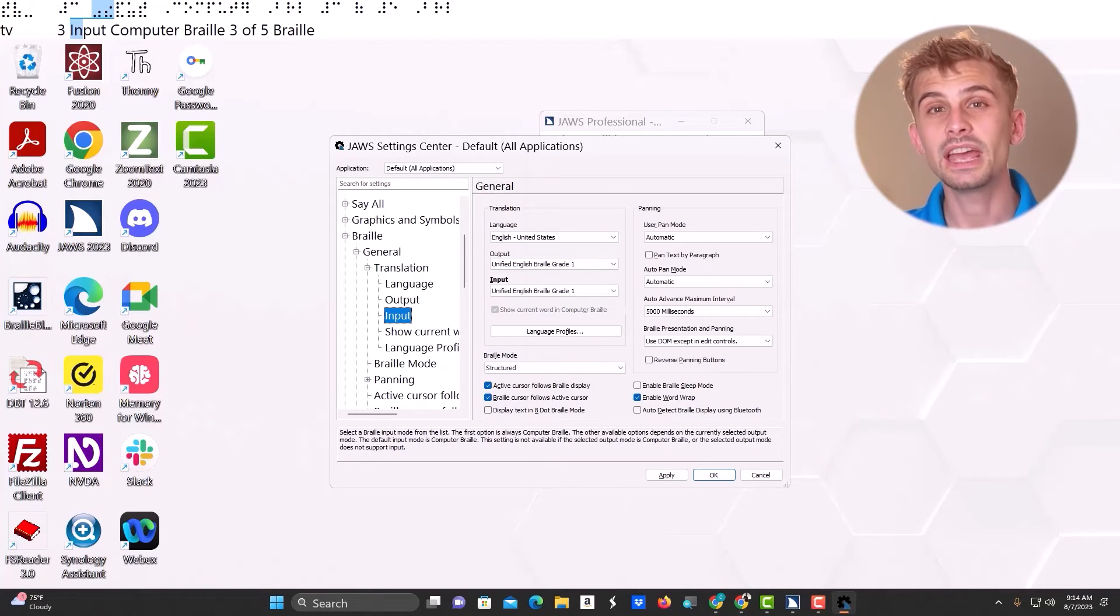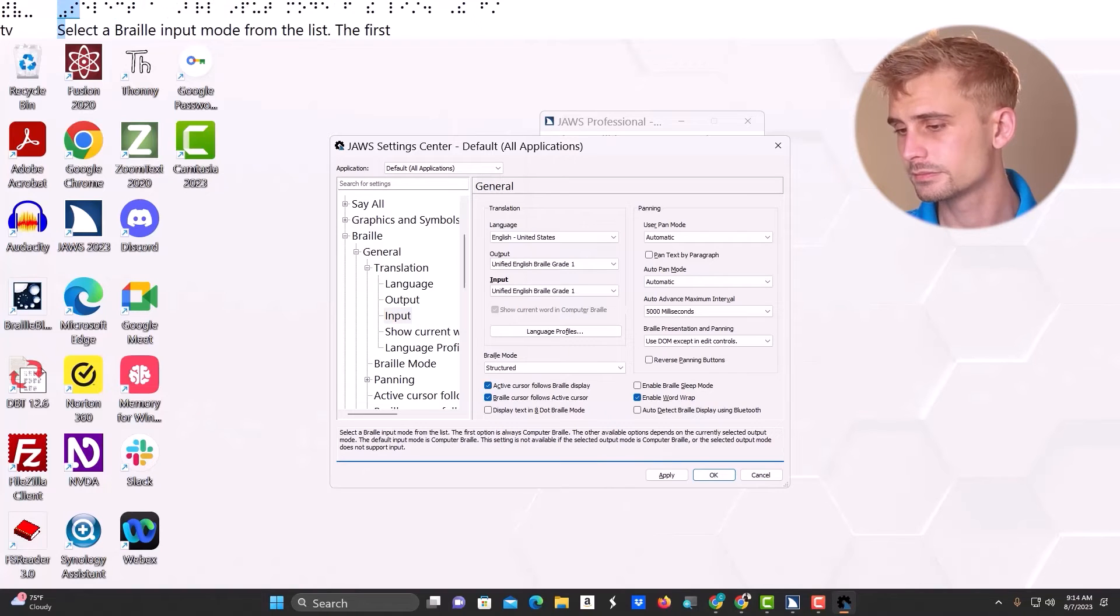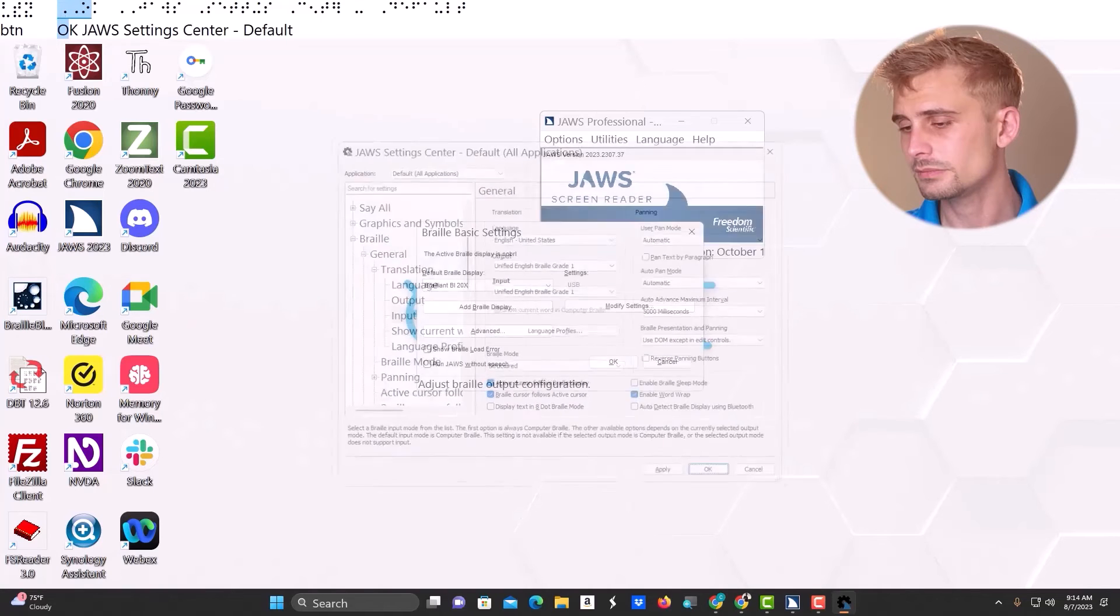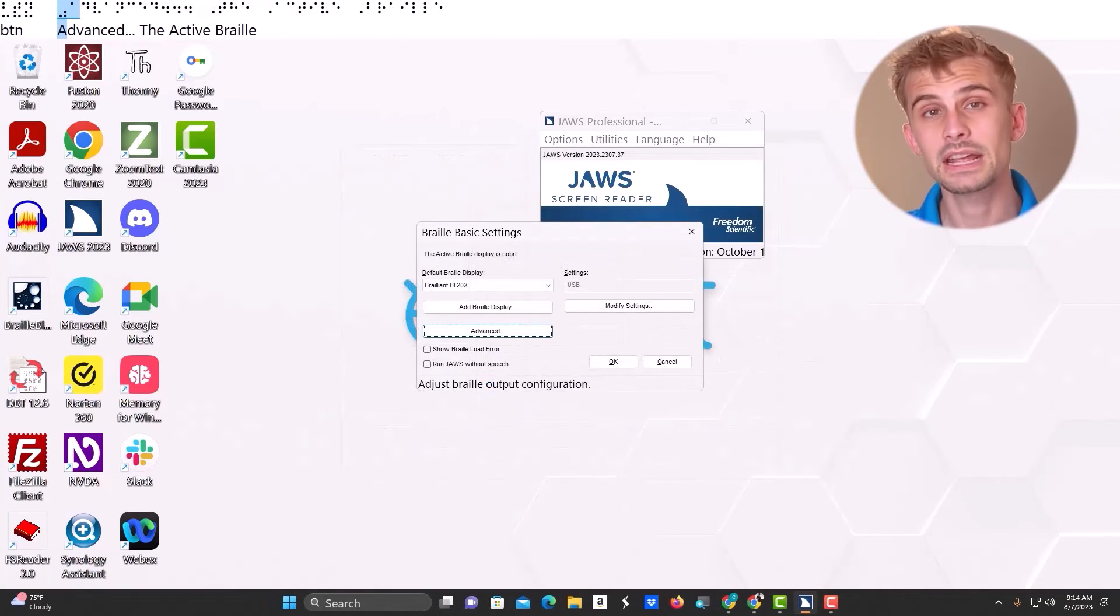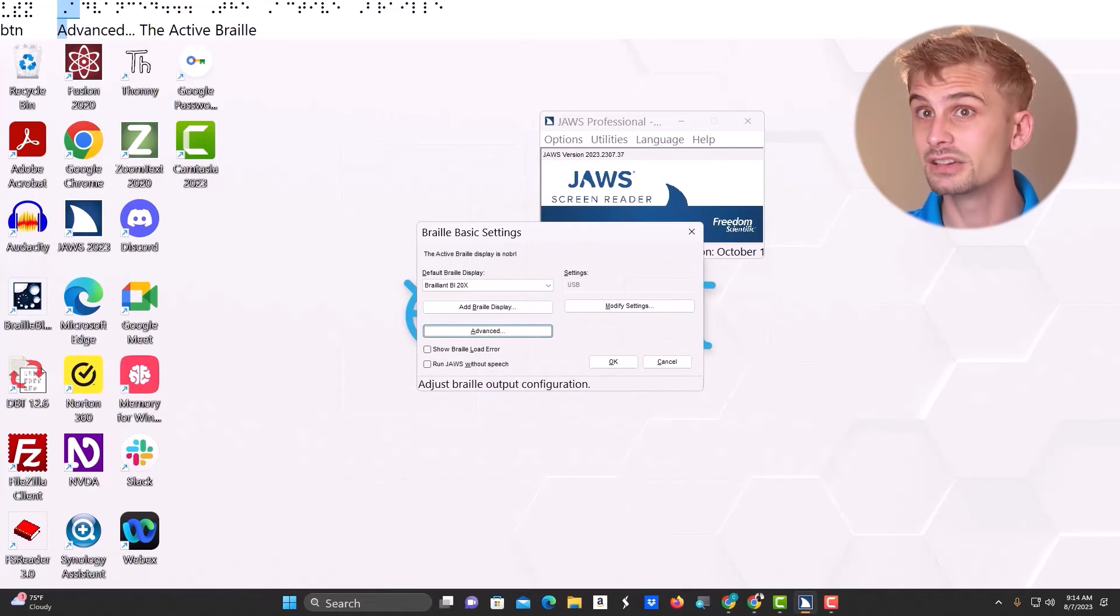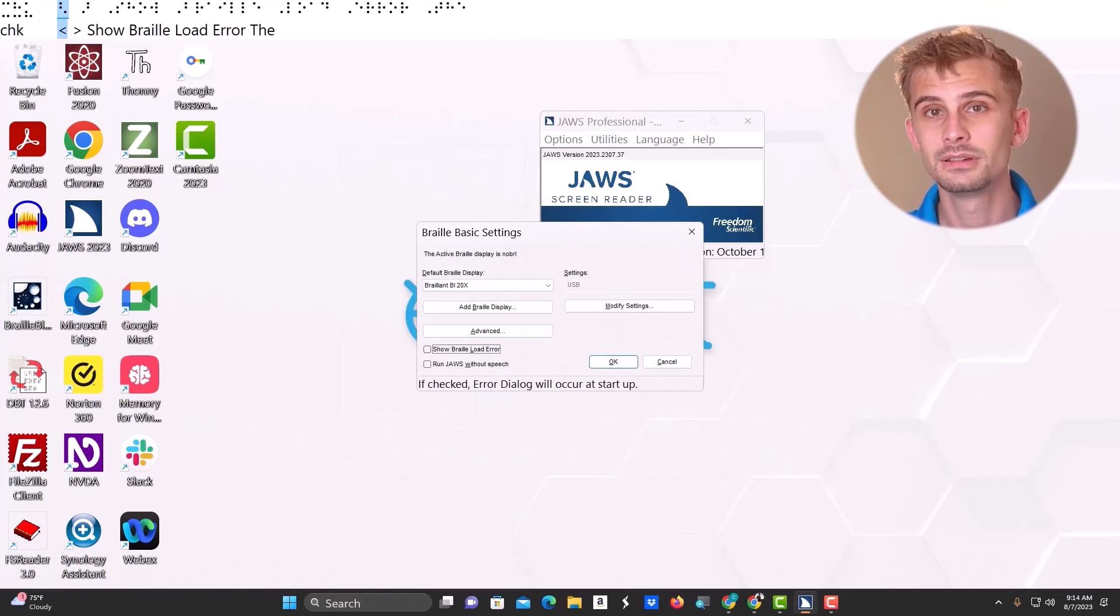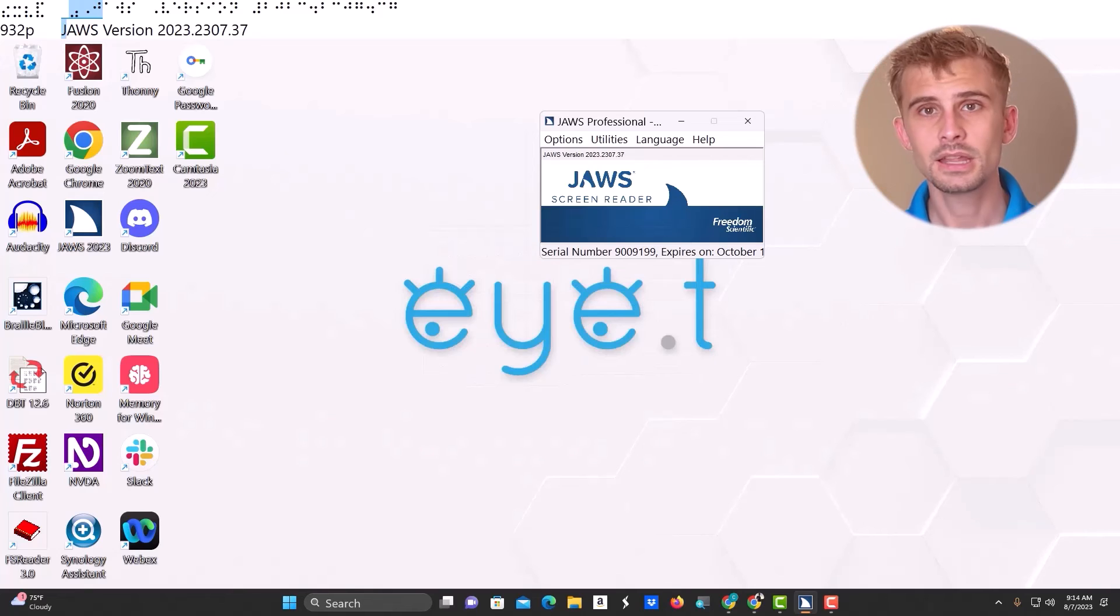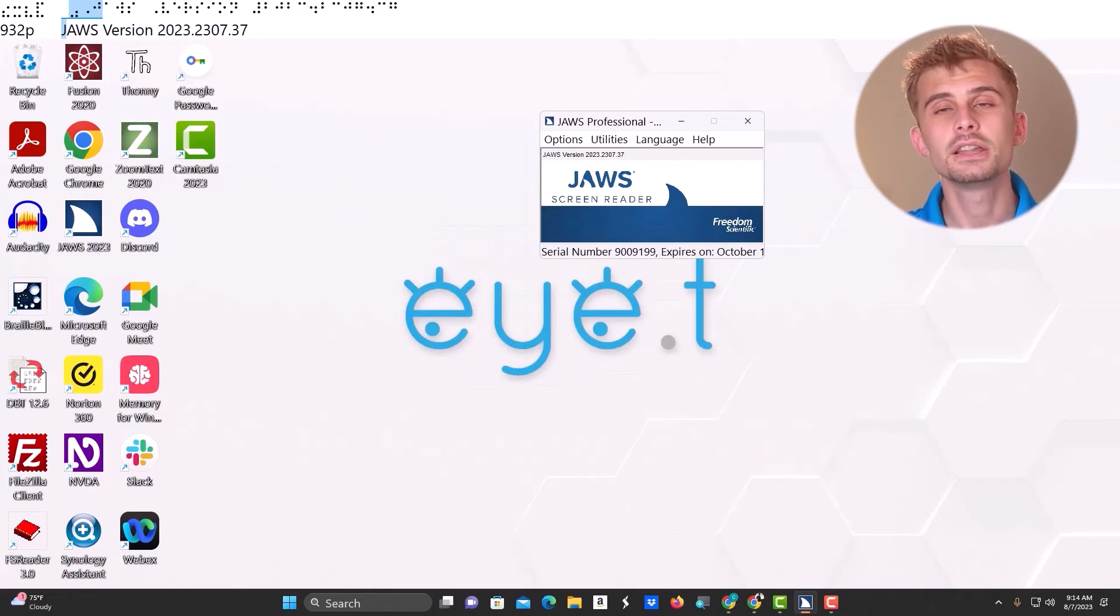I'm going to tab to OK. Press Enter. Now I'm back in my braille basic settings dialog. So again, I need to tab to OK. And that's it. You can see that the braille on my braille viewer now shows uncontracted braille.